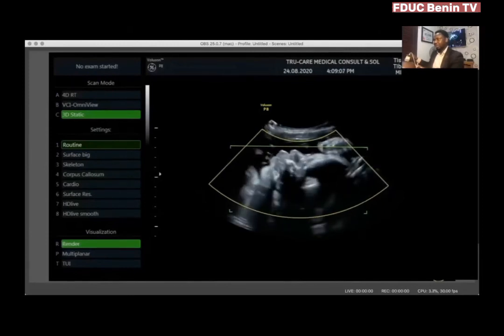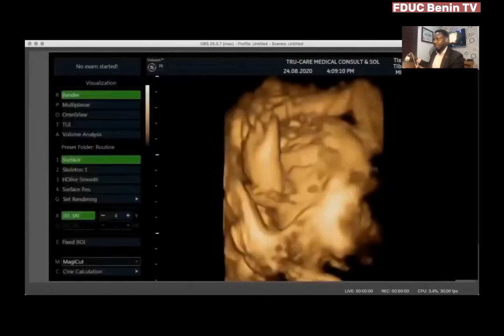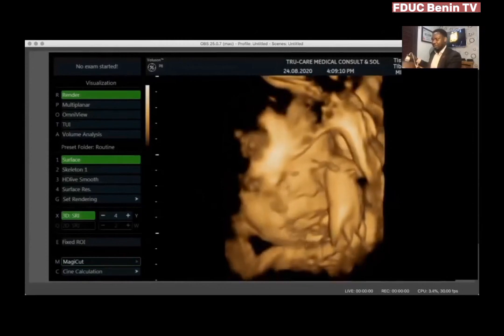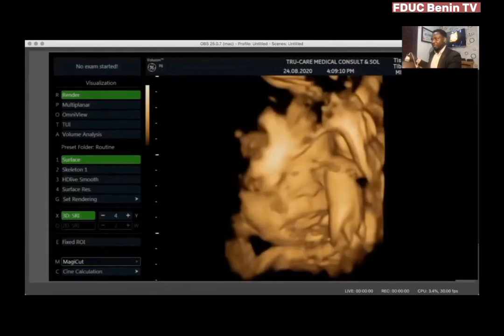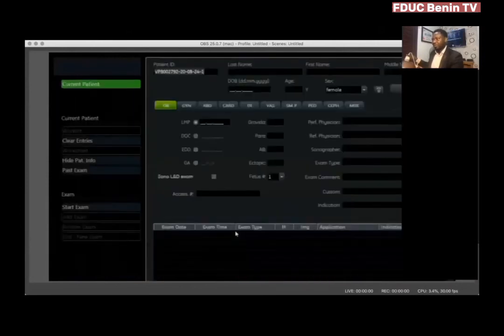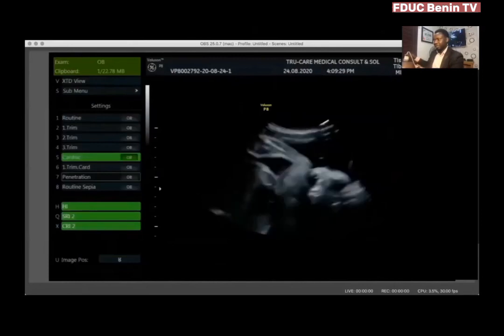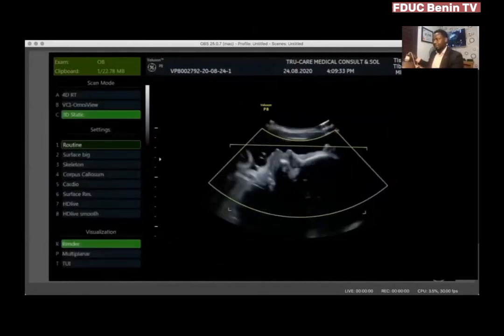Sometimes you just quickly need to adjust. This is a little close to the nose, but then again, you see, when I begin to play around with the gain, this is not the best image. I'll save this because again, there's the ability to do a lot of post-processing. I'm going to deliberately take some artifacts in so that we'll be able to bring them out as we scan.